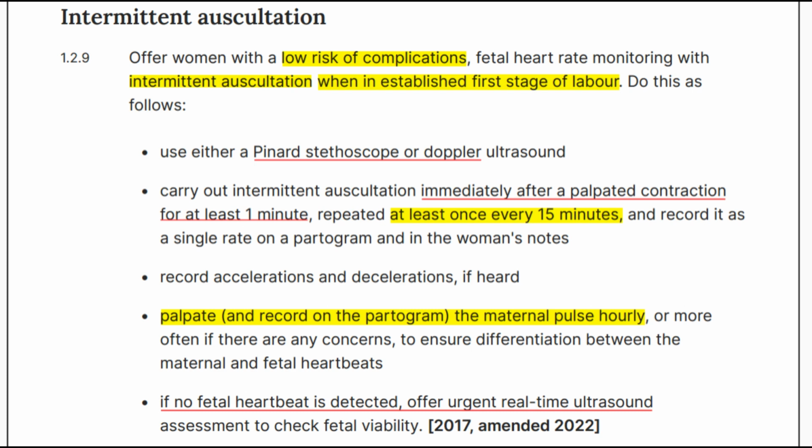Record accelerations and decelerations, if heard. Palpate and record on the partogram the maternal pulse hourly, or more often if there are any concerns, to ensure differentiation between the maternal and fetal heartbeats. If no fetal heartbeat is detected, offer urgent real-time ultrasound assessment to check fetal viability.